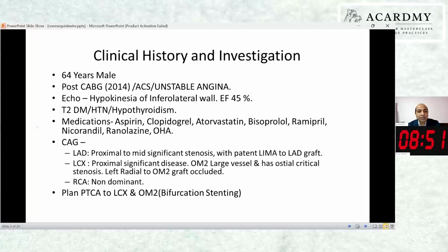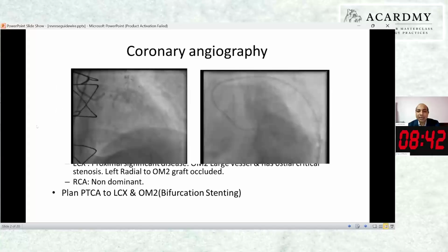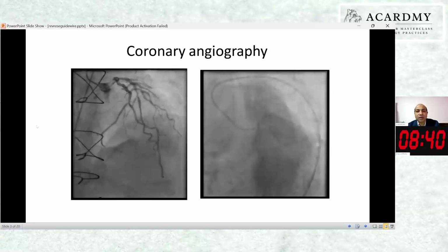So we planned a PTCA to LCX and OM2 with bifurcation stenting, two drug-eluting stents. We chose mini crush as the technique for the bifurcation.